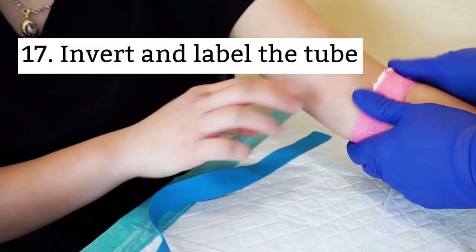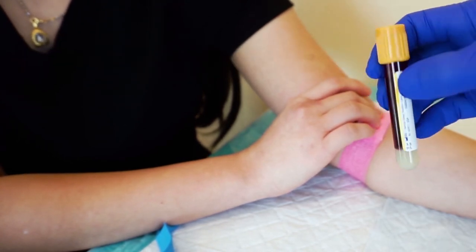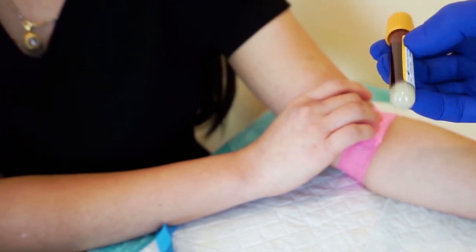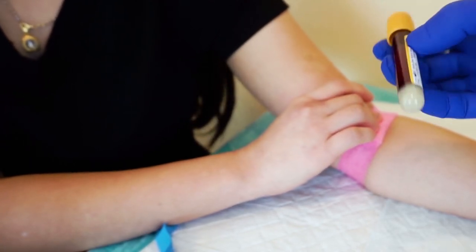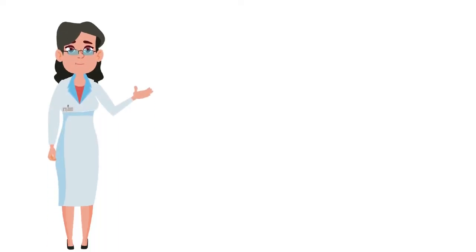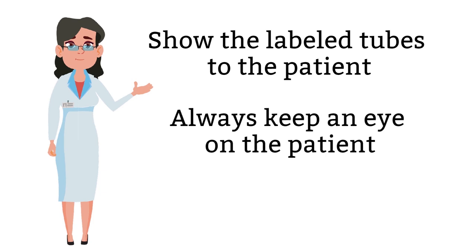Seventeenth, invert the tubes a few times and label the tube with the patient's information. Generally, on the label, you should include your initials, date, and time of draw. As soon as you are done labeling the tube, let the patient take a look and verify that the information is correct. While you are doing this, you will also keep an eye on the patient, making sure that the patient is doing okay and not fainting.